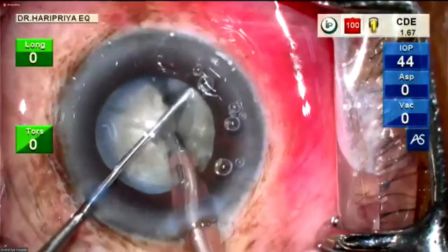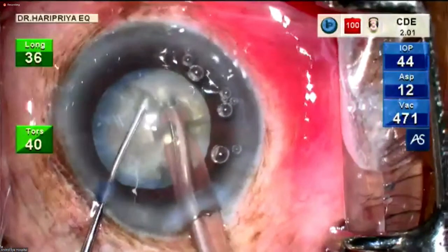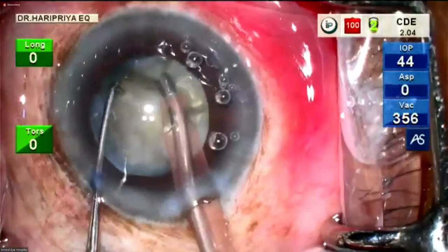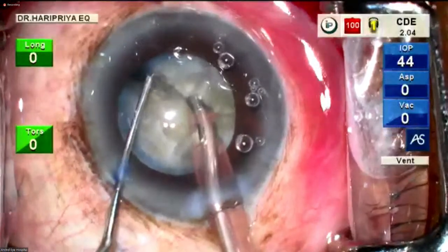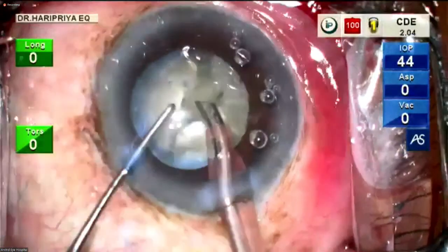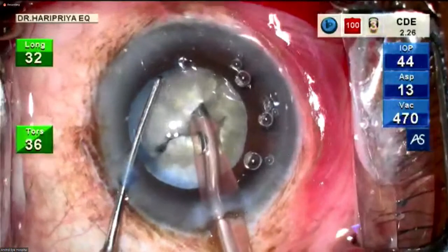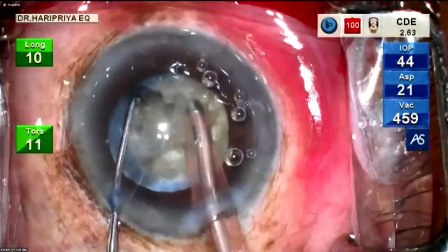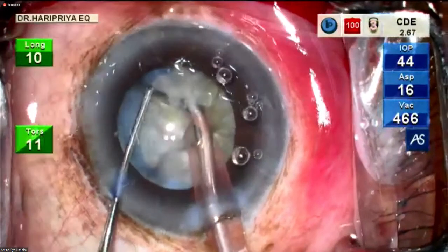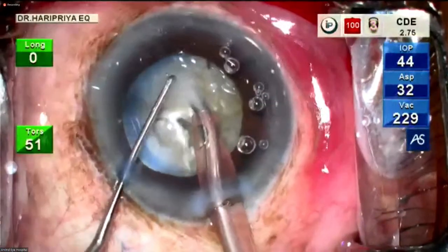So you're using the same drops on the cornea. Same chopper. The same chopper, yes. So with the vertical chop, I do the horizontal or the vertical chop. Now, a slightly oblique motion could also be useful, slightly from the periphery, and then a diagonal movement, combining the horizontal and vertical movement, can also be useful to chop in these cases.